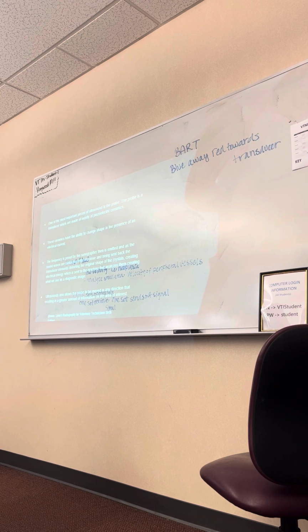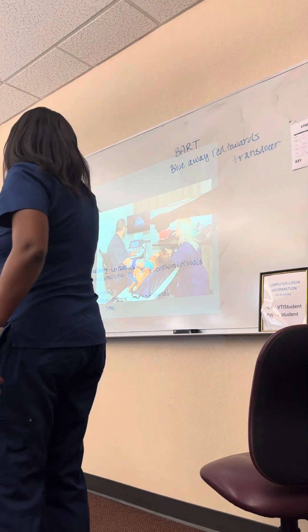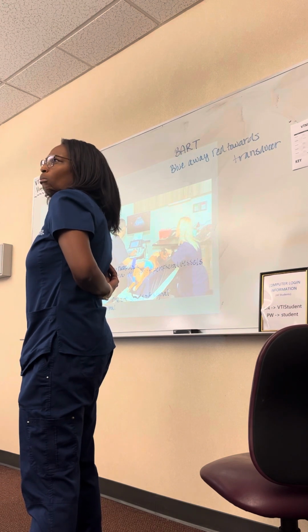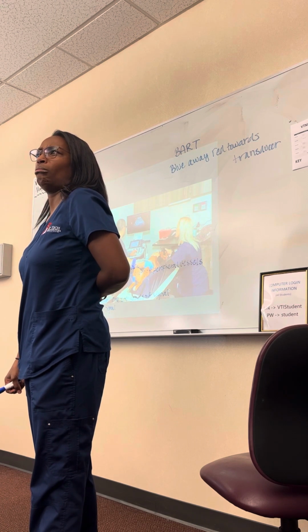Because on the actual ultrasound, when you have the probe on the patient, how it looks on the screen. Like that image, it's not exactly a triangle. It was basically asking you how it looks on the screen, the shape. There was another one that was confusing.